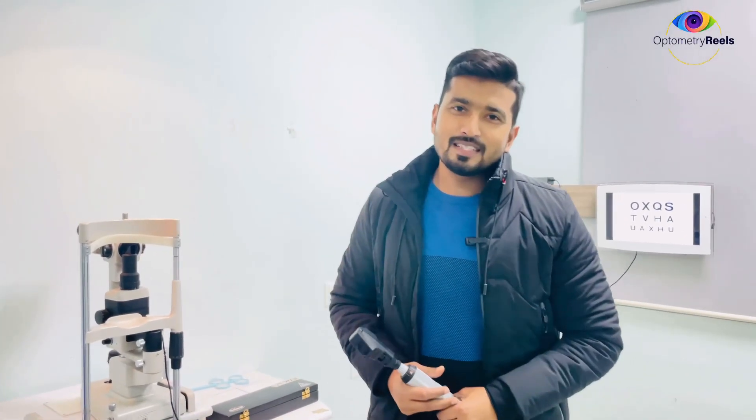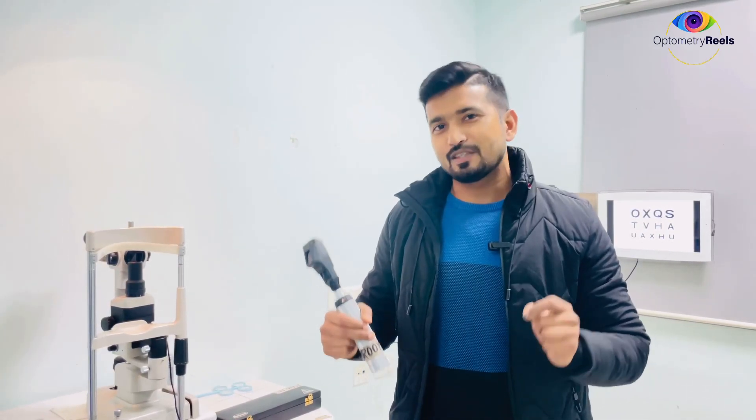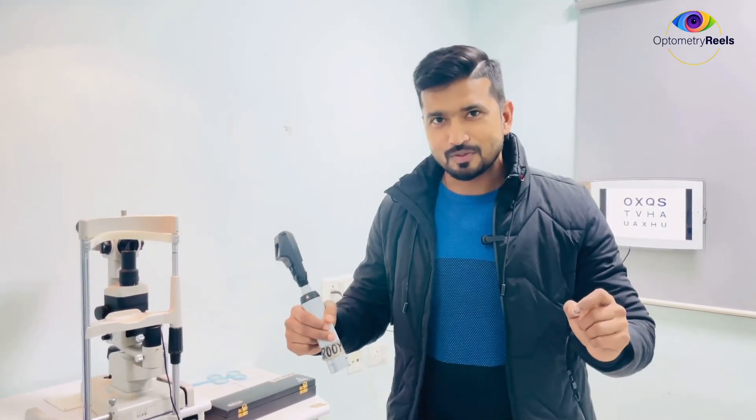Hello and welcome to OptoMaterials. Today in this video I am going to show you another important technique of retinoscopy which is Mohindra retinoscopy.